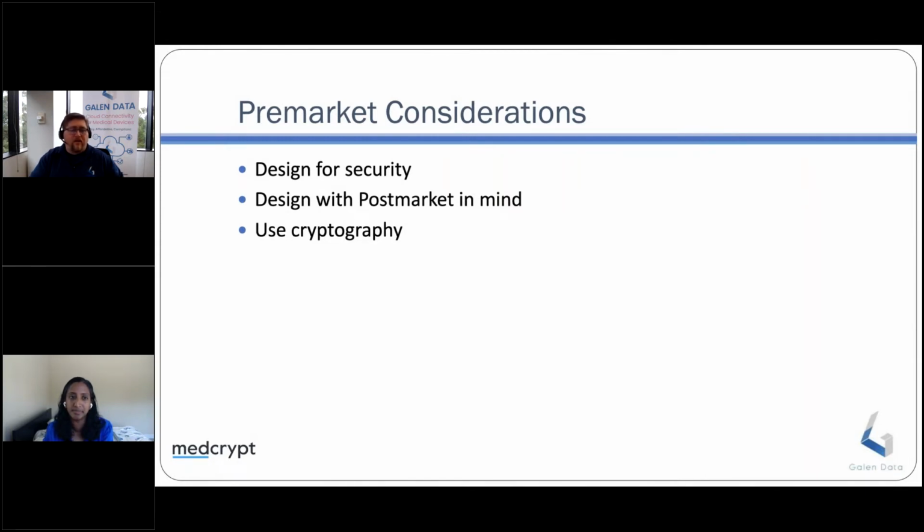It wouldn't surprise me if you're seeing devices that are a year to a year and a half out from the latest version of any software, just because a typical hospital may have 500, 600 devices, a heart monitor or an insulin pump or any type of bedside equipment like that. It's a huge effort just to go around and update and touch every single one of those and track every single one of those.